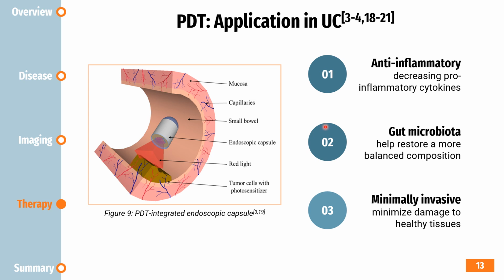And lastly, localized and minimally invasive treatment. PDT is well suited for ulcerative colitis as it can be delivered endoscopically, allowing for precise targeting of inflamed areas. This localized approach minimizes systemic toxicity, reducing the side effects. New advancements, such as shown here, which is the endoscopic capsule, can further enhance PDT's minimally invasive potential.